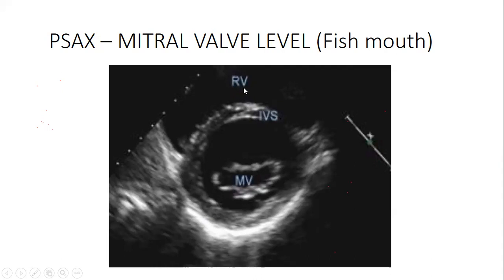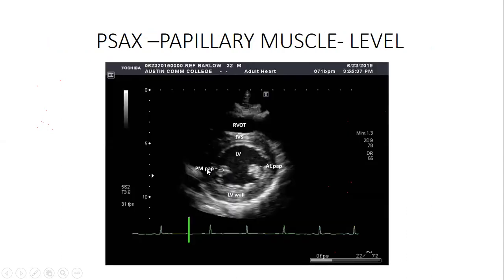Then the right ventricle. Now, this view is very, very important in cases of myocardial infarction. We are not discussing myocardial infarction, but I'll come and explain the motions here. Very, very important. Make sure you get the best image. Very good in myocardial infarction to understand.